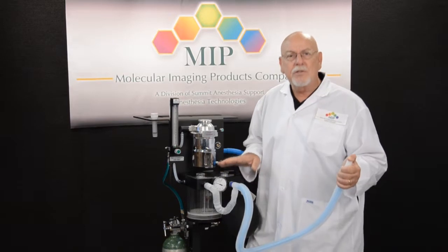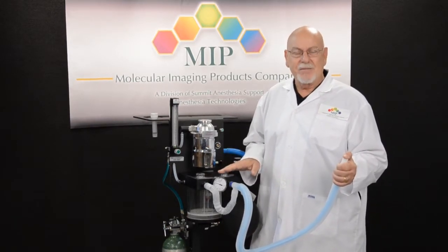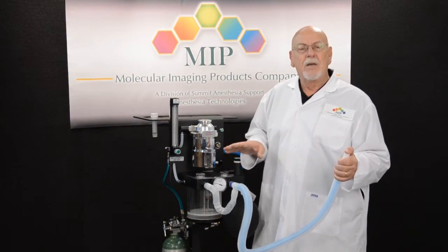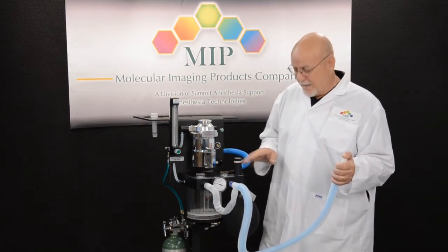Please understand we do not want you to put this much pressure when an animal is on the anesthesia system. We're just putting this amount of pressure in the system to stress it so that we can find out if we have any leaks.